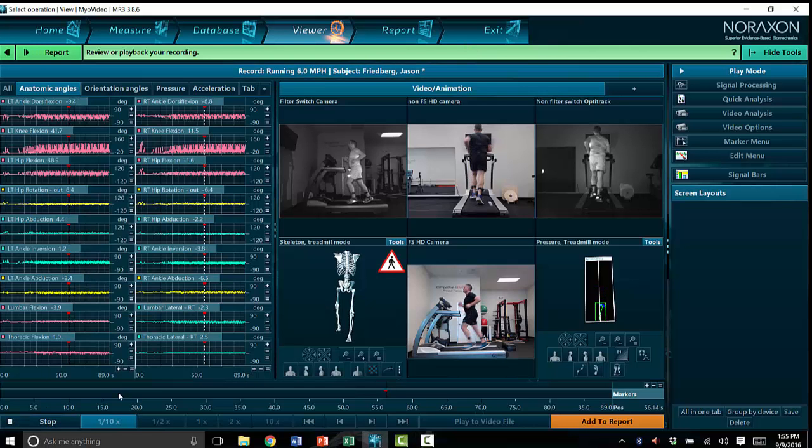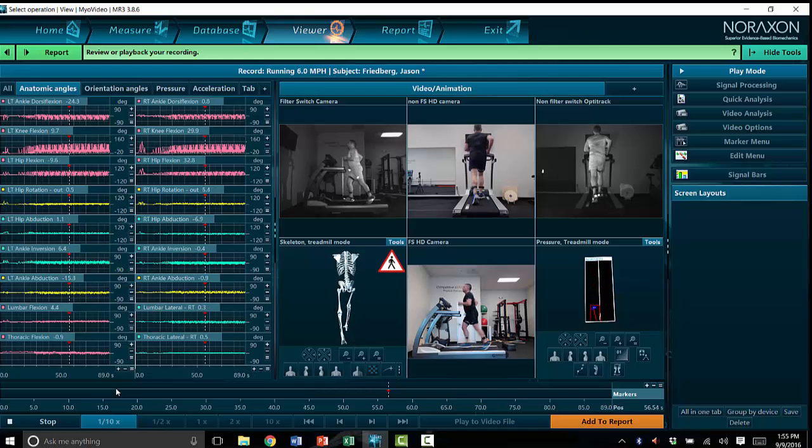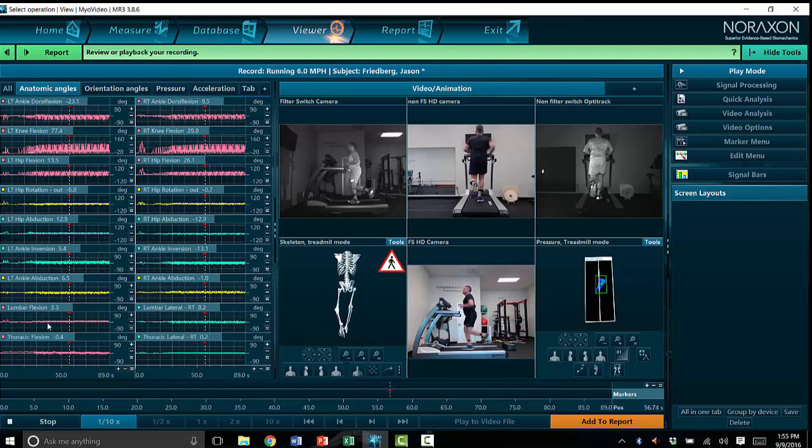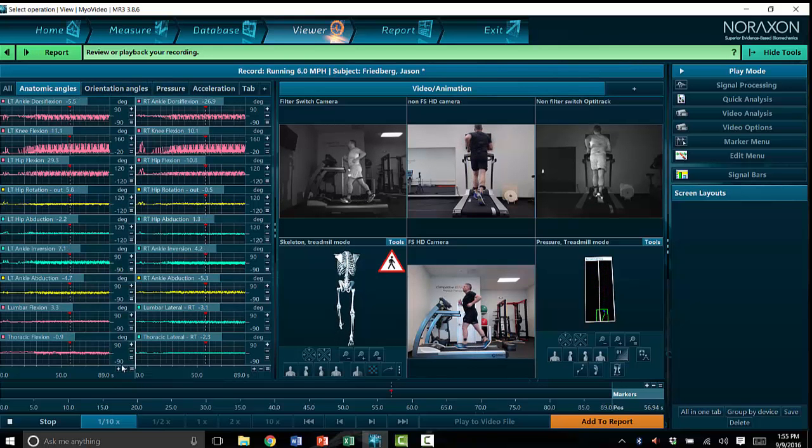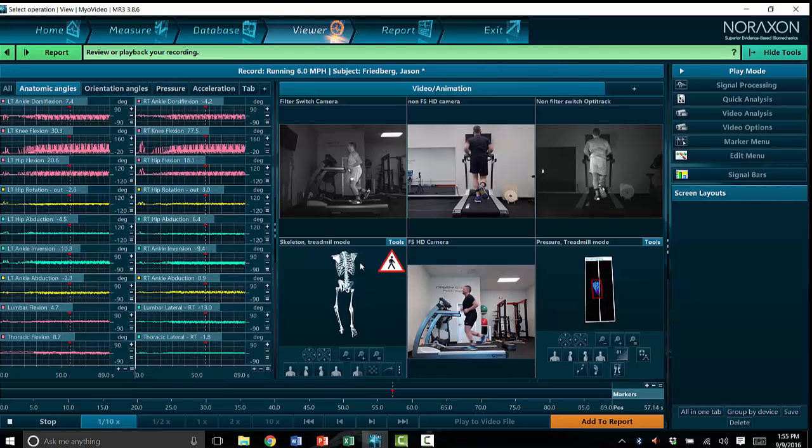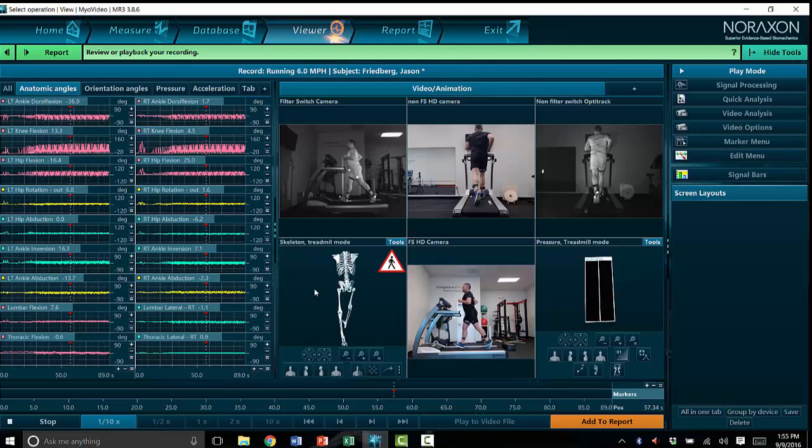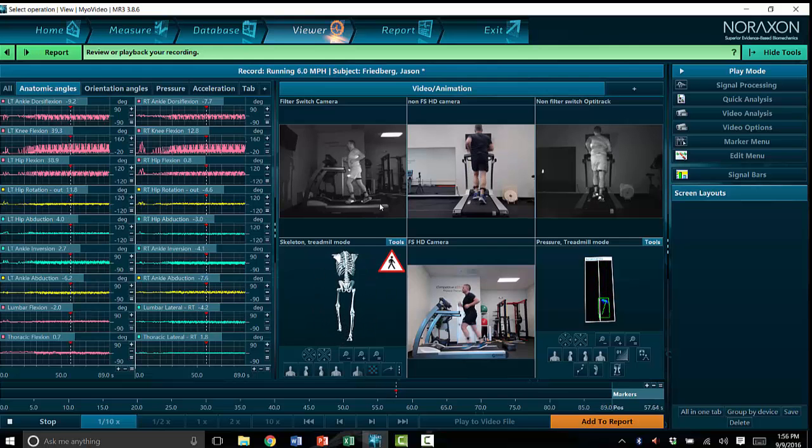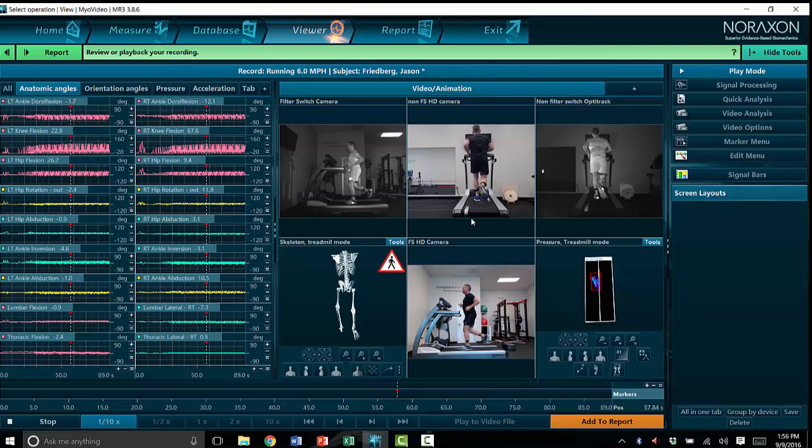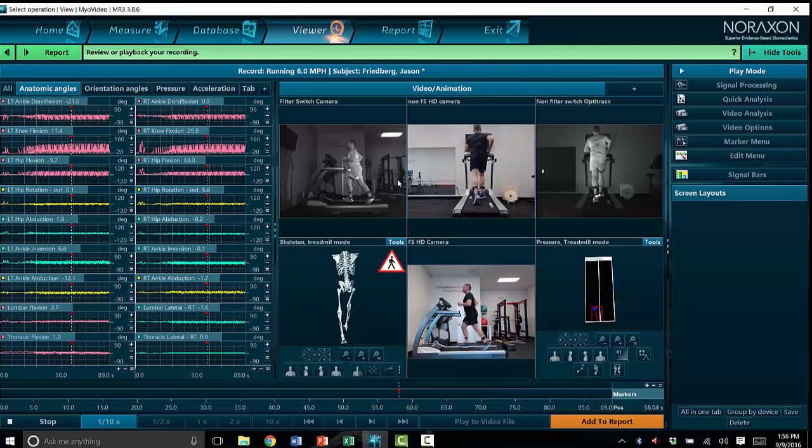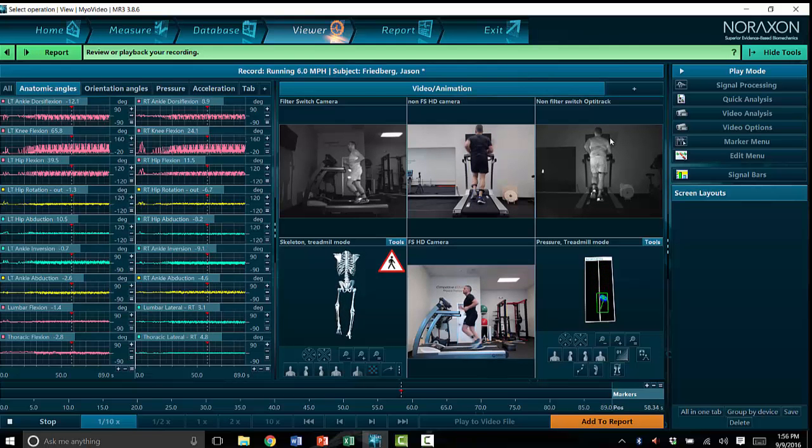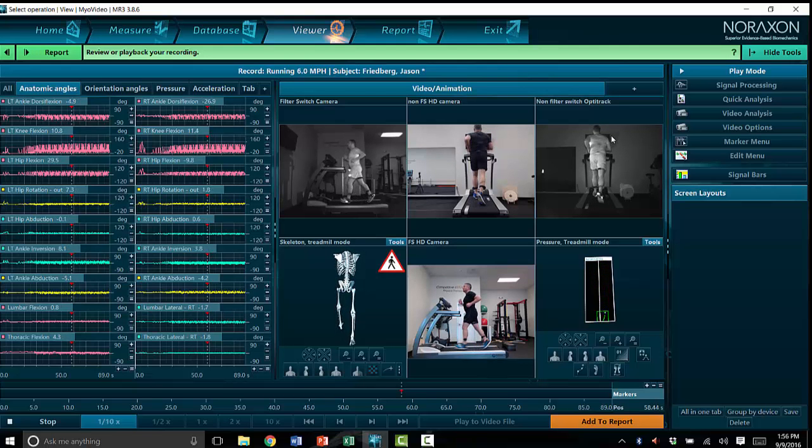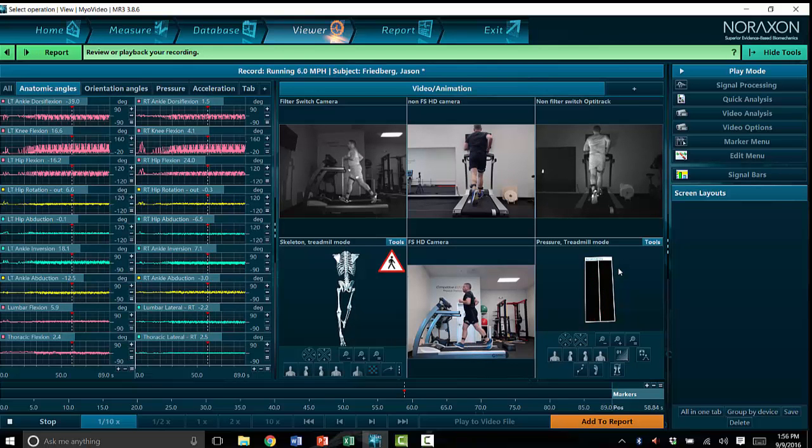So what you see here is how we look at and analyze gait here at our lab. We have our 3D angle measurements in real time here, sensitive to within a degree of motion. Here we have the 3D representation as a skeletal avatar of that data. And then we have HD video here at 30 frames per second, and in black and white we have 100 frames per second grayscale. And then down here we have our pressure mapping of each individual step during the running assessment.